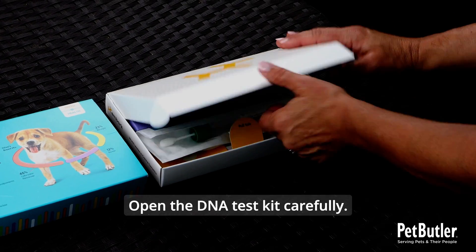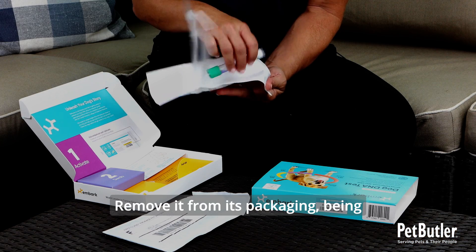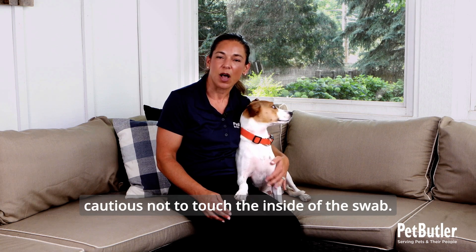Open the DNA test kit carefully. Inside the kit, you'll find a sealed tube. Remove it from its packaging, being cautious not to touch the inside of the swab.